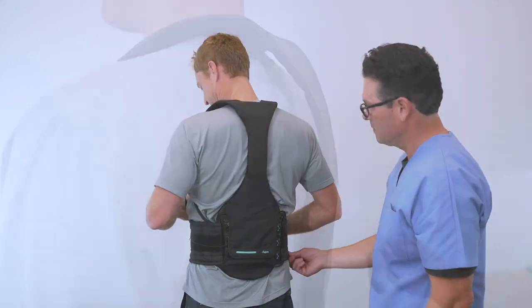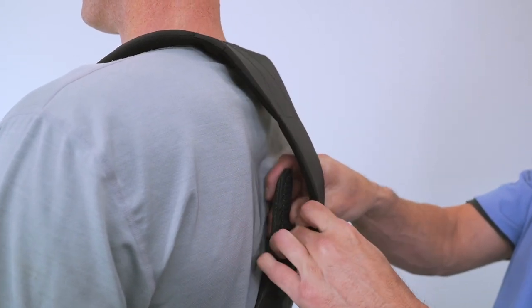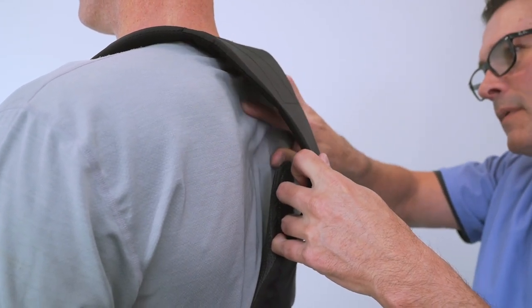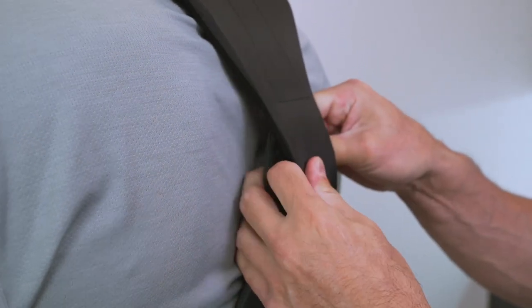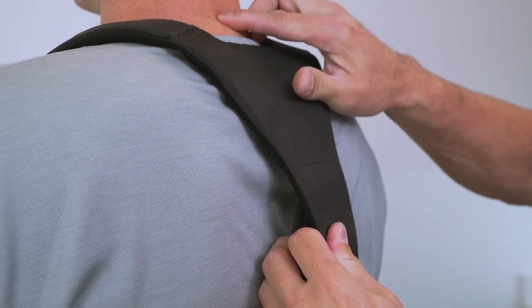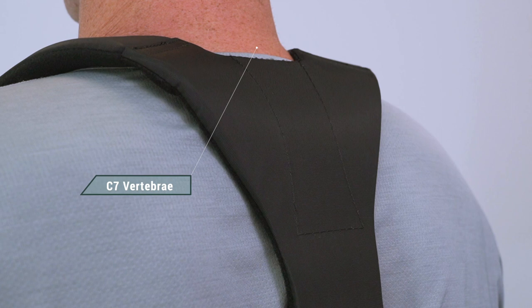To adjust the height of the back panel during the initial fitting, disengage the hook and loop near the top, just below the Y of the shoulder straps. Slide the outer part of the back panel up or down so the Y of the back panel rests at the top of the shoulders, just below the C7 vertebrae.